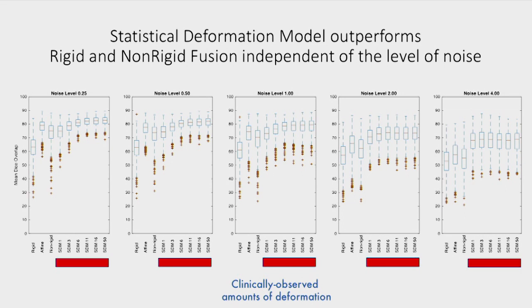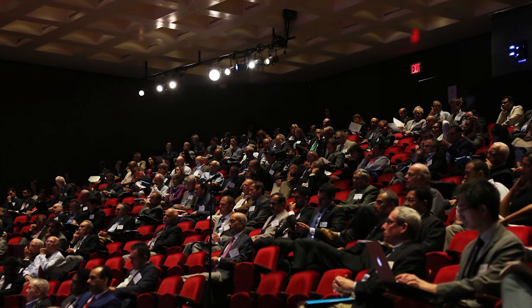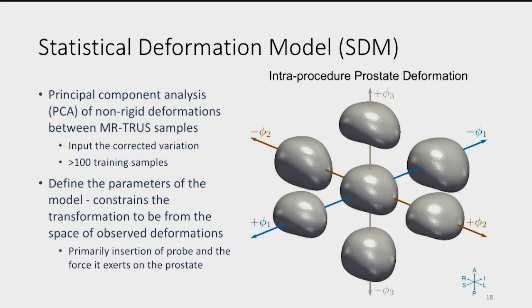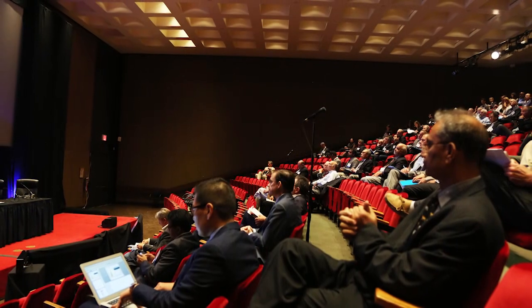Right, and thinking about the question again, we create the fusion, and then we're biopsying in real time. So the fused image would be moving with the needle, and I can't imagine that the needle is creating that much of a change with respect to internal targets. But it's something that we can look at. But you should watch. So if you're at the peripheral zone, you have a posterior lesion, and you fire, and it's a very dense, high-grade disease, it could bounce off. So you need to keep your eyes on the ultrasound.